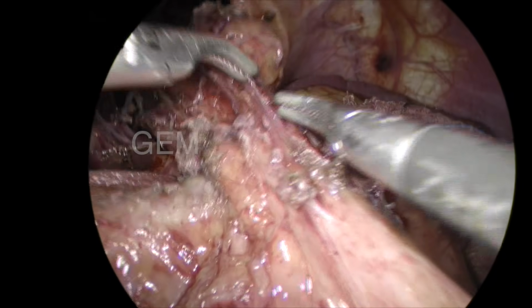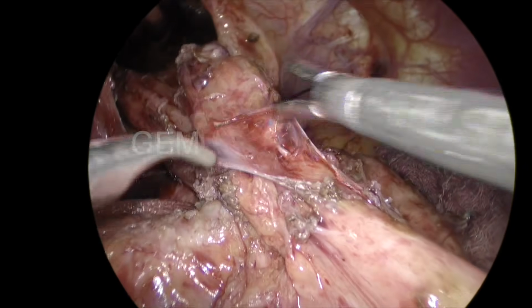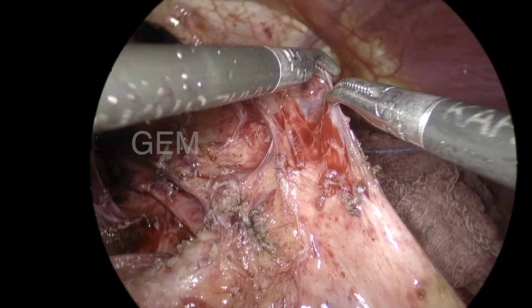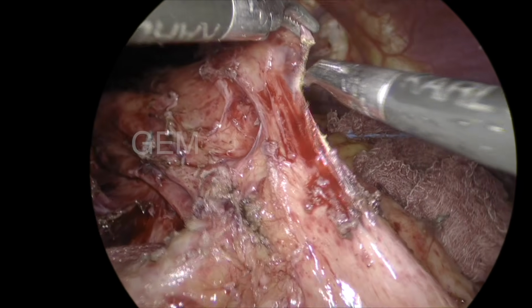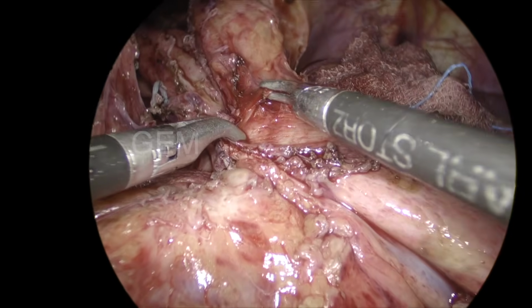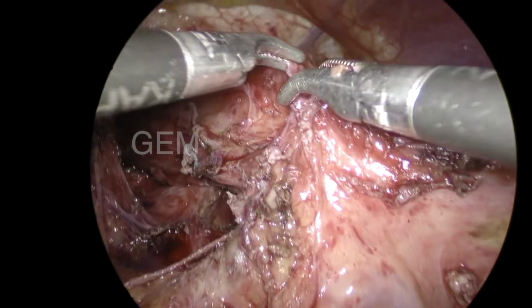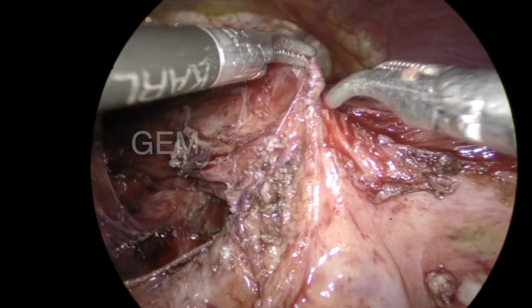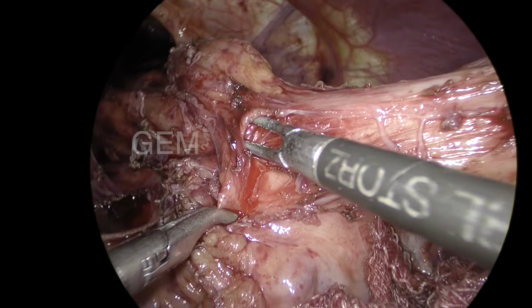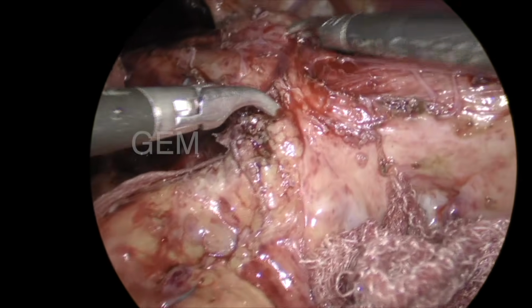The stomach was inside the hiatus for a long time. Because of the compression by the body of the stomach, that area is a little bit fibrosed, and I'm not able to get the muscle clearly like in a normal case. So that's why I'm doing it very slowly, fiber by fiber and layer by layer. Always for myotomy, I use two Maryland forceps, in both right and left hands, and the cautery will be in the right hand.